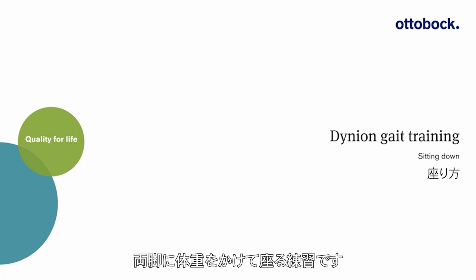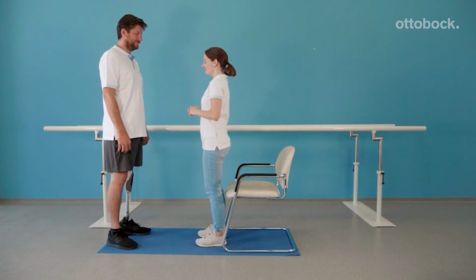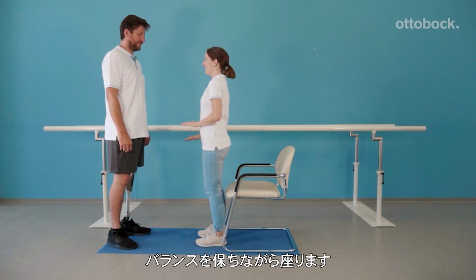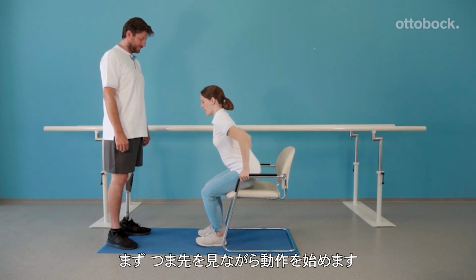Practicing sitting down helps to relearn loading both legs equally. Demonstrated here is how to distribute weight evenly on both legs and to keep the center of mass over the feet. Follow the principle nose to the toes.